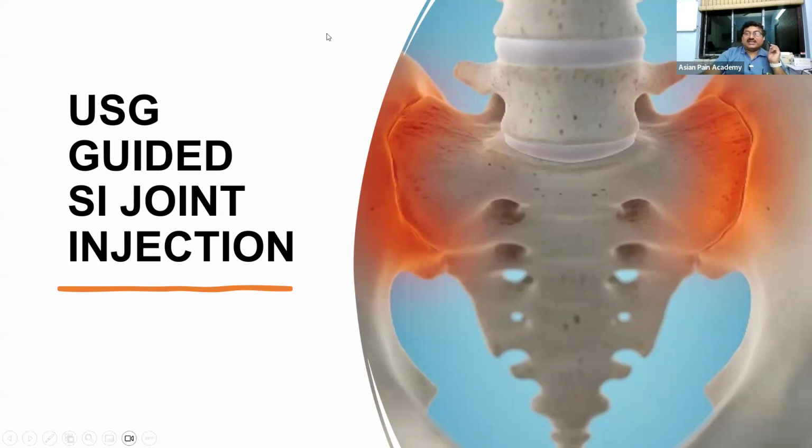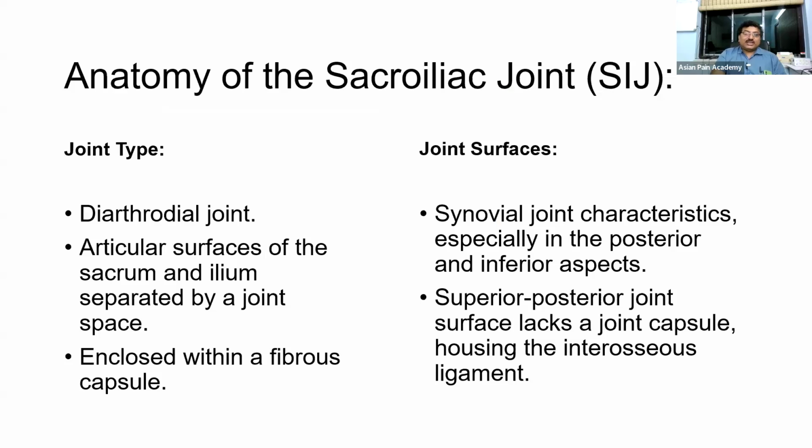Our next procedure is such that here under ultrasound, we are getting a huge advantage, and nowadays almost all my sacroiliac joint injections are ultrasound guided. I don't do them under fluoroscopy anymore. So, what is the sacroiliac joint?